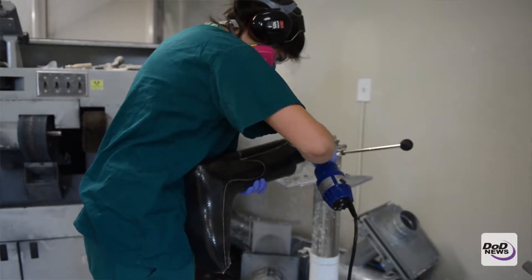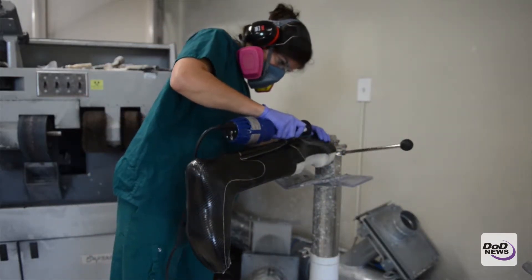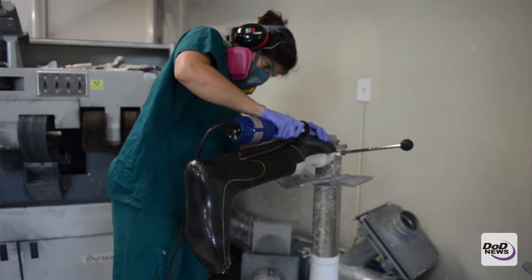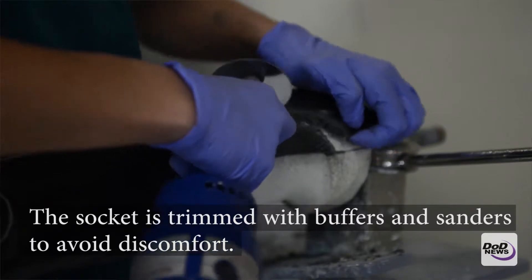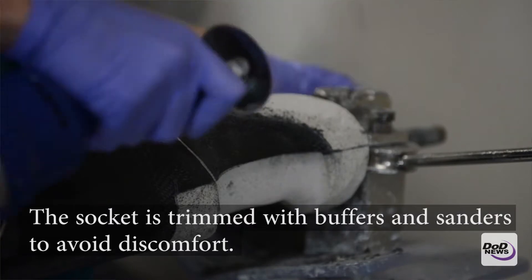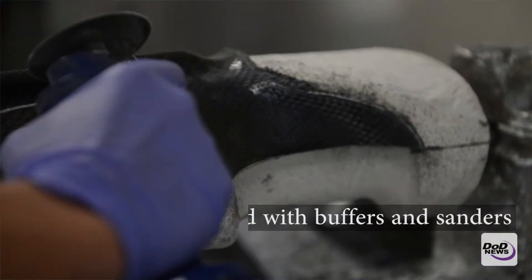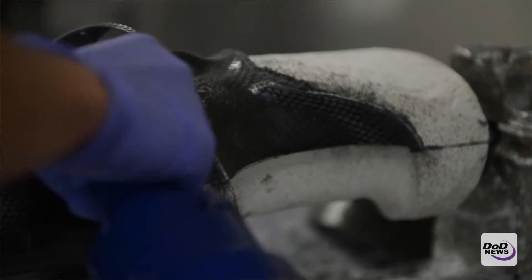After we've created a socket, they take the socket, which is still on the mold, and take it back there. They would cut it out with the cast saw along where the trim lines are, take it off the mold, and at that point they would smooth up the edges on the trim lines so as not to cause any discomfort on the patient.